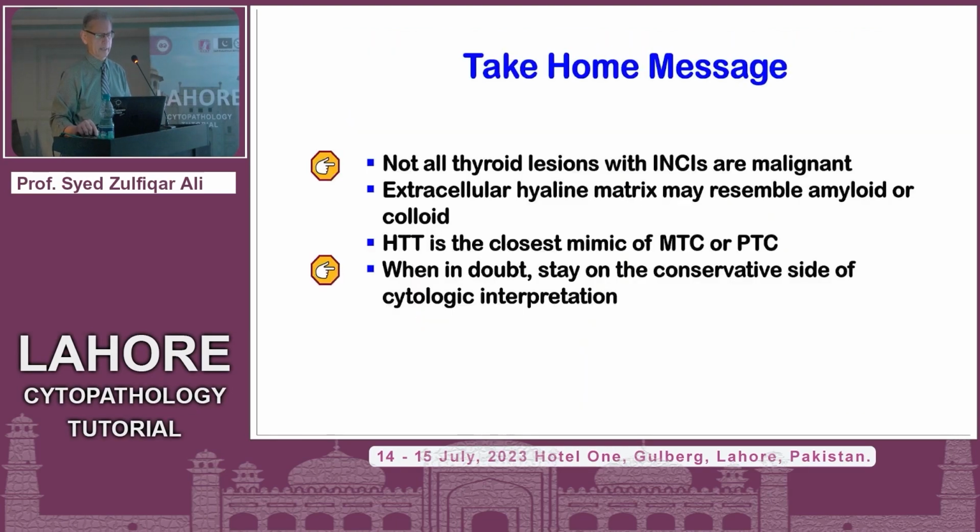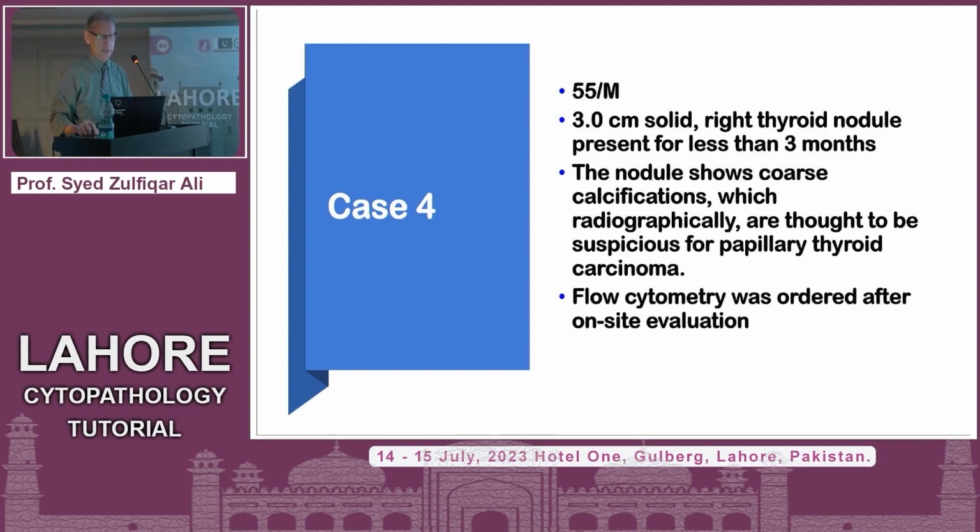And again, that's a reference, take-home message. Not all thyroid lesions with intranuclear inclusions are malignant, and certainly HTT or HTA is a close mimic of MTC and PTC. Whenever you have doubt, you're not confident, just stay on the conservative side. Call it follicular neoplasm and express the differential diagnosis.